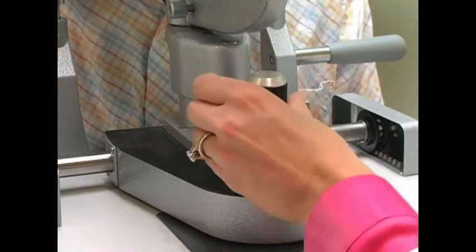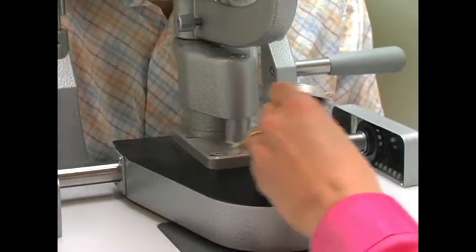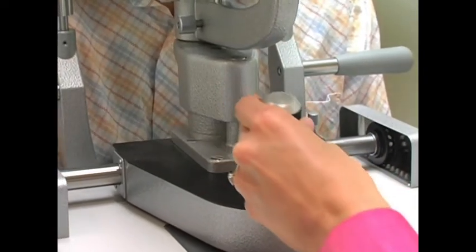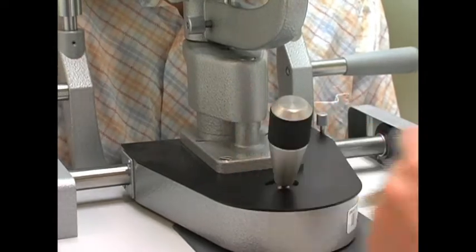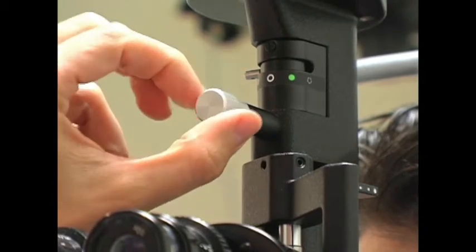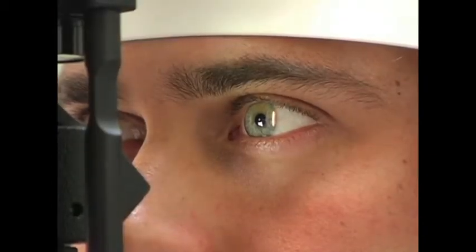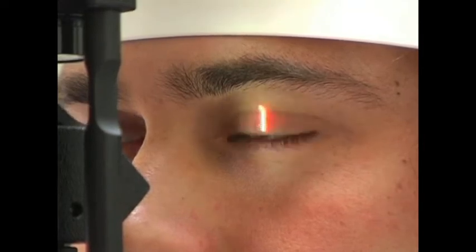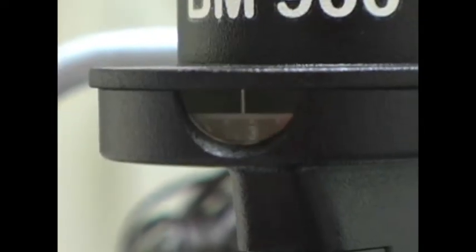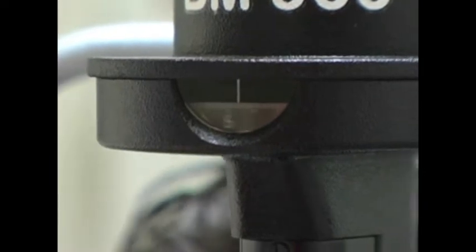The joystick is used to move the light source up and down by turning the handle. Moving or rotating the joystick to the right and left causes the light source to move correspondingly. Focus is achieved by moving or rotating the joystick forwards or backwards. The upper control knob is used to adjust the length or height of the light beam. The number gauge next to the upper control knob tells you the length of the beam in millimeters and can be used to estimate the size of a lesion.